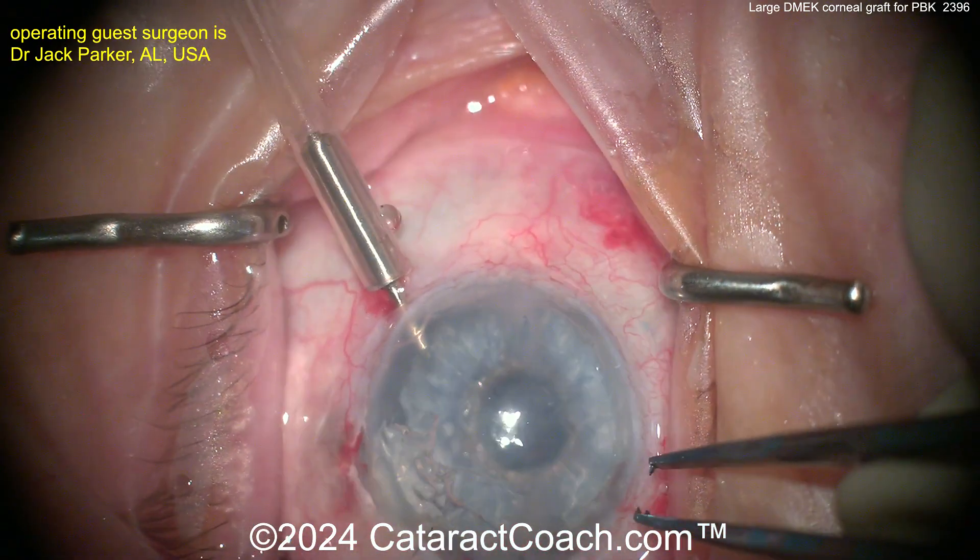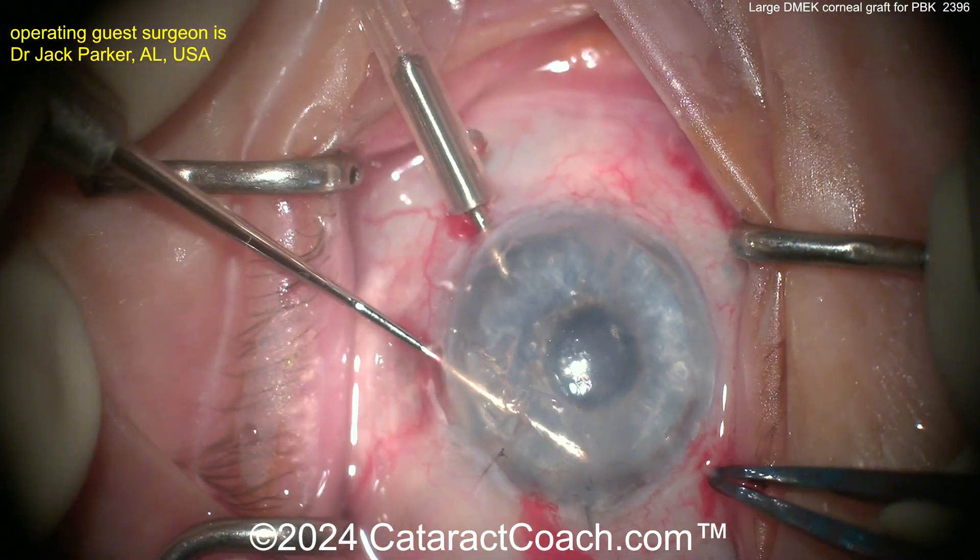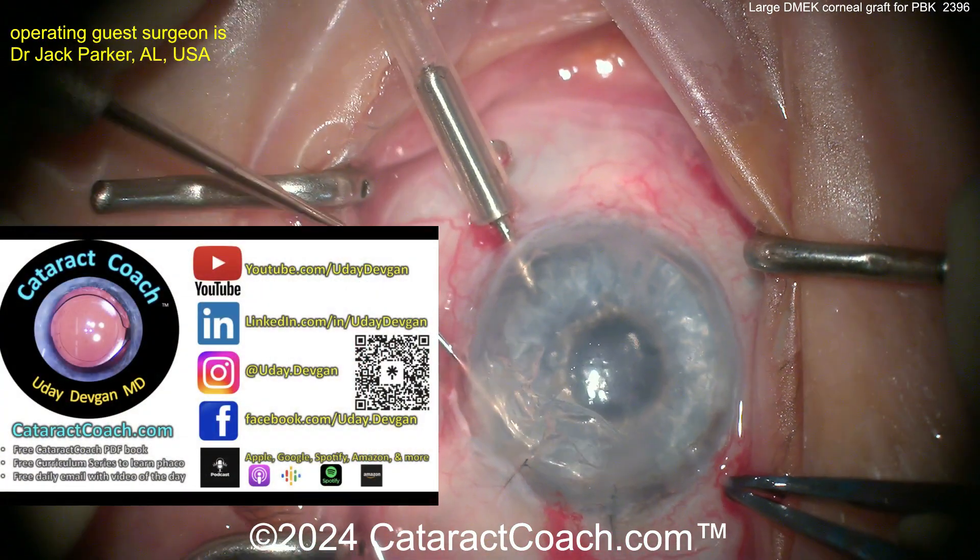Once that's freed up, removing that. With doing so many of these — 20 per day often — this surgeon has a tremendous expertise.